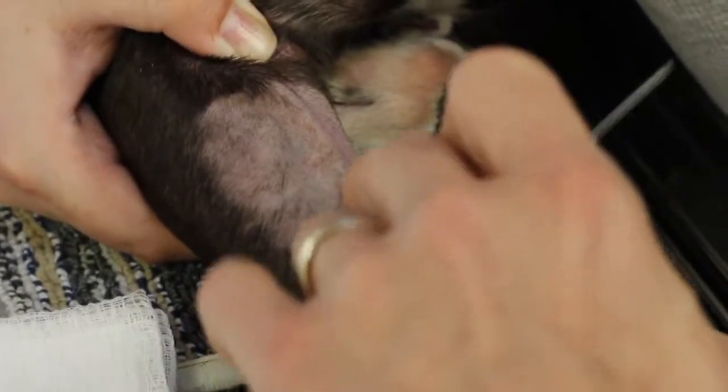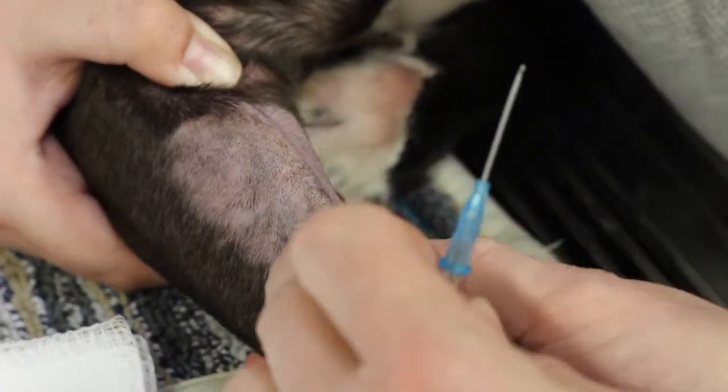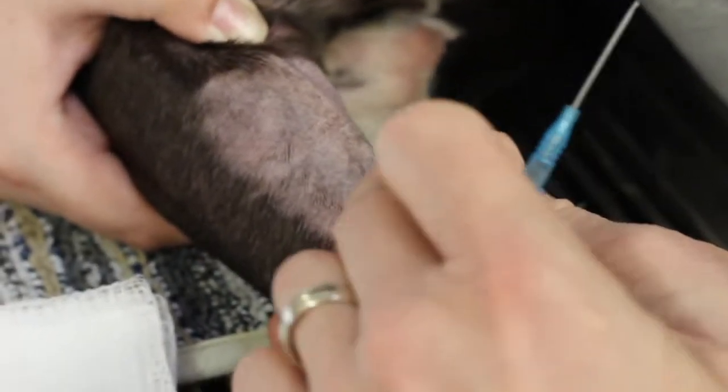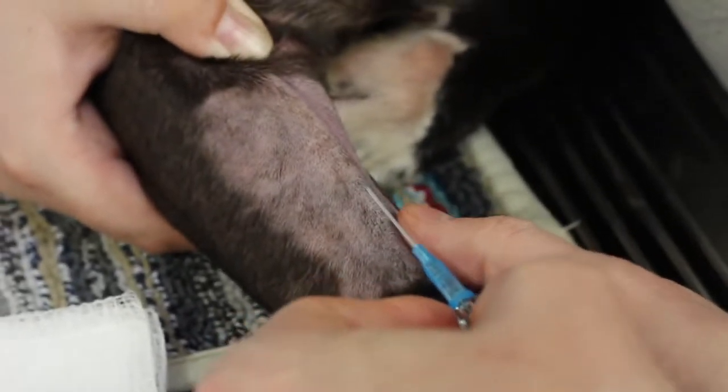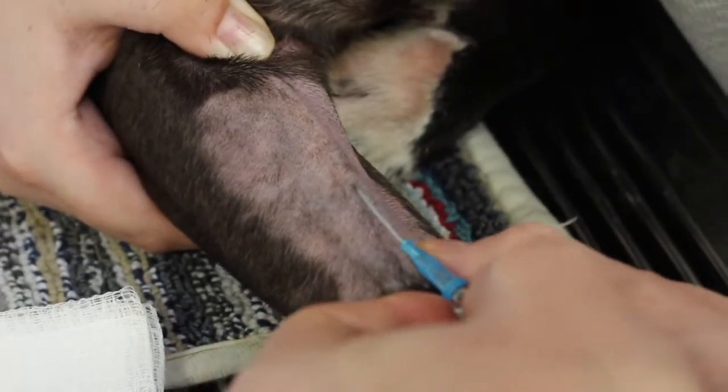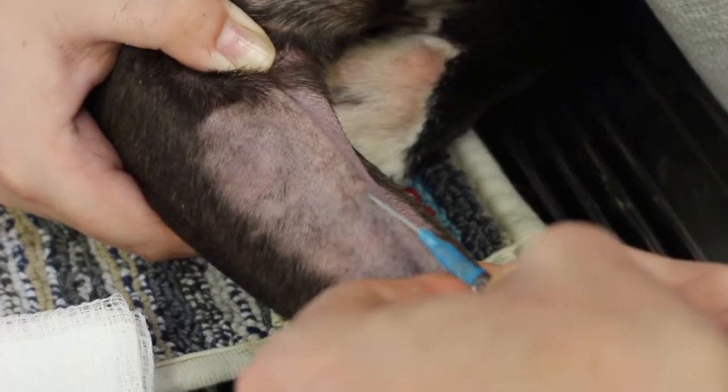If I bounce this vein — you can see it standing up nicely. Sometimes she's got a firm vein, but sometimes it rolls under the skin. If you move it like that, you can get a visualization of where it is. You can see the vein. And I try to get right into the center of the vein and thread it up the vein just a touch.